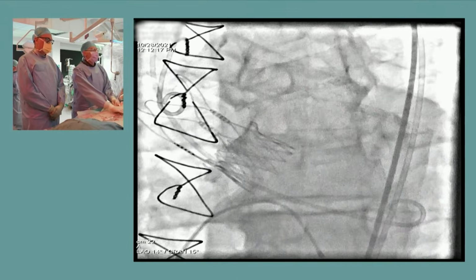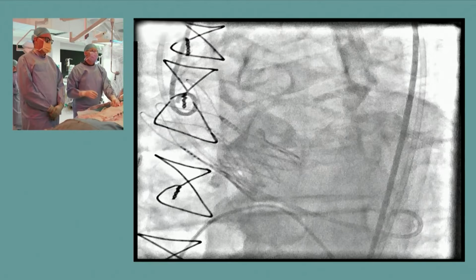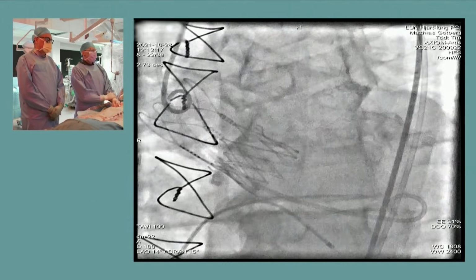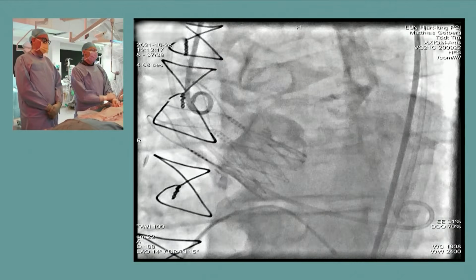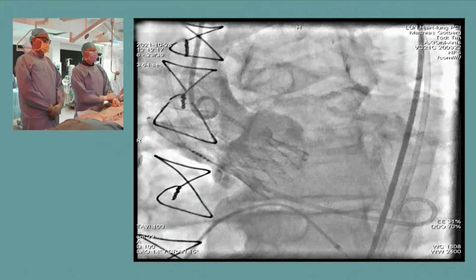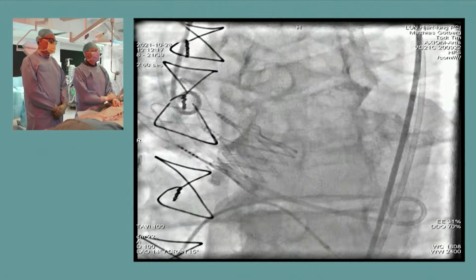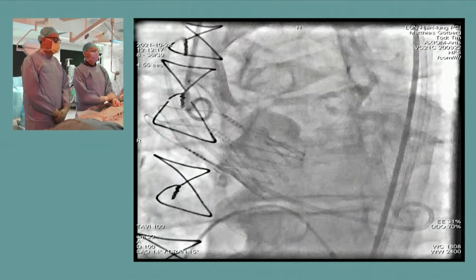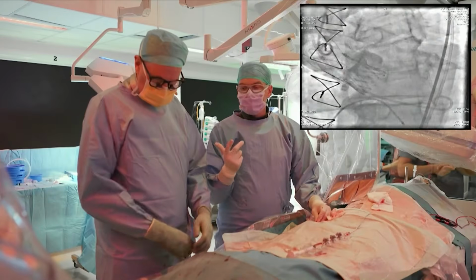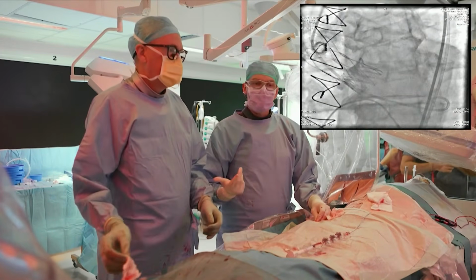It's a good question. I think the main message really is that regardless of which nuance to the technique you're using, it's actually very easy to achieve commissural alignment. Yeah. I'm still in two minds whether to use just the three-cusp view or a cusp overlap view. Obviously, when we're doing Evolut cases, we do a cusp overlap, but then again, we prefer to stay in the three-cusp view when you're doing the implant because it's really easy to check the forces you apply on the system when you are doing the actual implant.